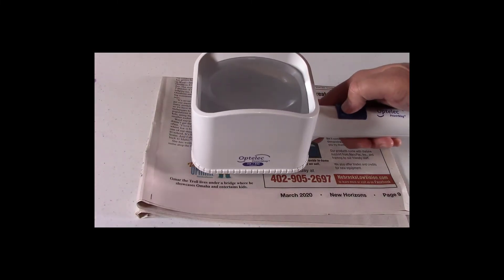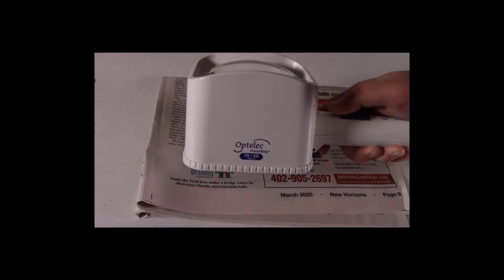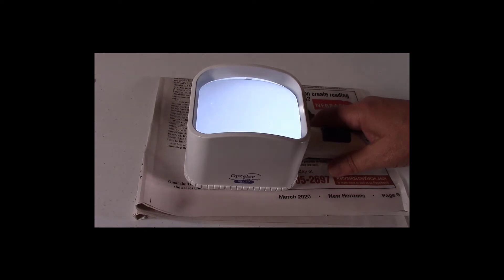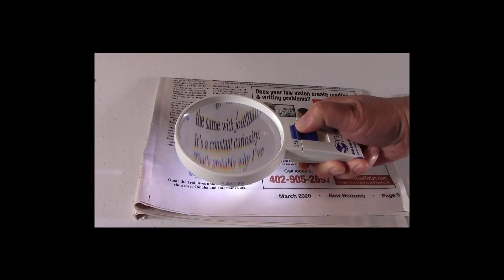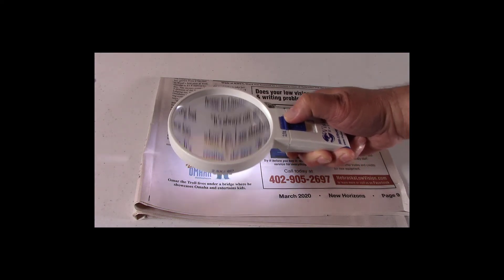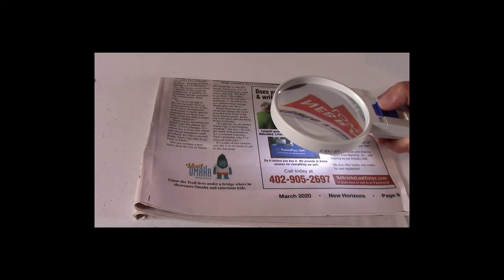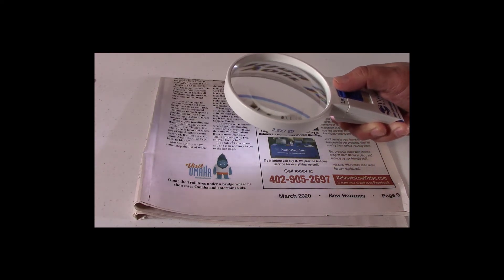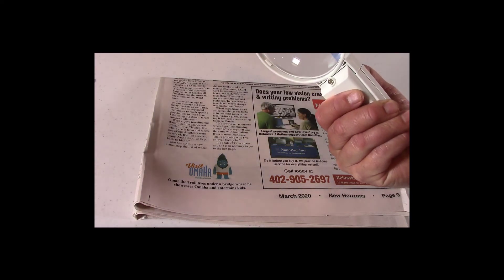The third difference is lighted versus non-lighted. Some magnifiers have a light and some do not; those with lights have replaceable batteries. Having a light on your magnifier is great when you are in a dimly lit area. Having a light also improves the contrast, making it easier to read print and look at color photos. And if something looks better with no light, you can simply turn the light off.